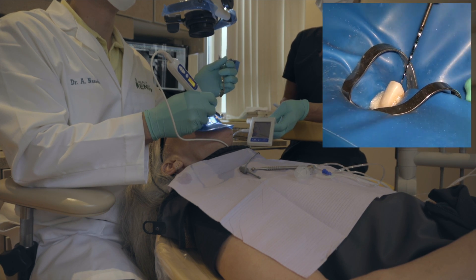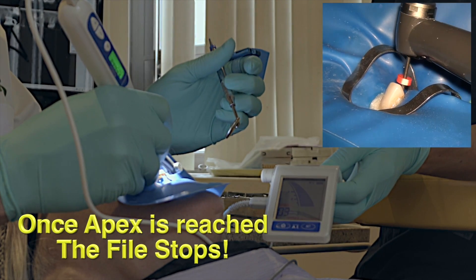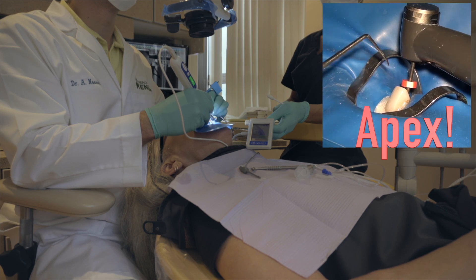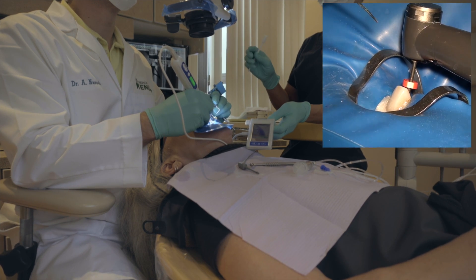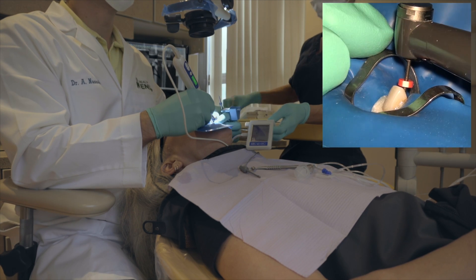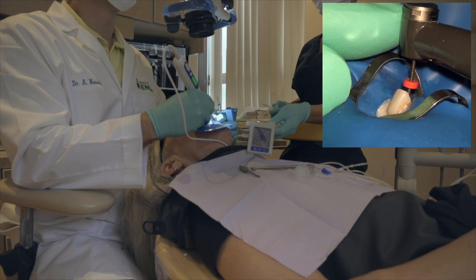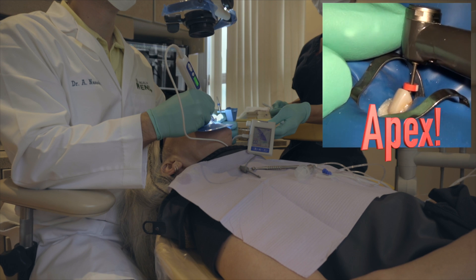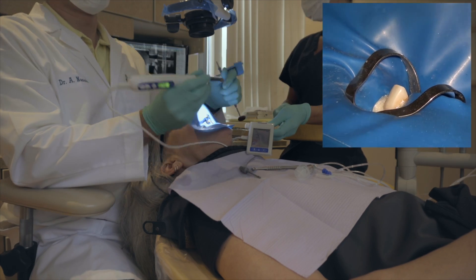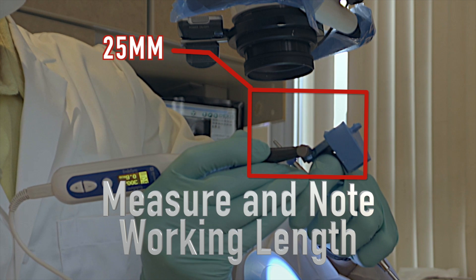Here you can see we've reached the apex and the file came to a full stop. The assistant can adjust the stop, but what I've found is that sometimes you're looking at the tooth from a different vantage point and you end up with the stopper at the wrong reference point. Make sure it's always at your line of sight so it's a consistent stopper-to-reference-point relationship — that's very important. I confirm it by going up and down a couple of times to make sure it's always stopping at the same point, which indicates a true and accurate working length.